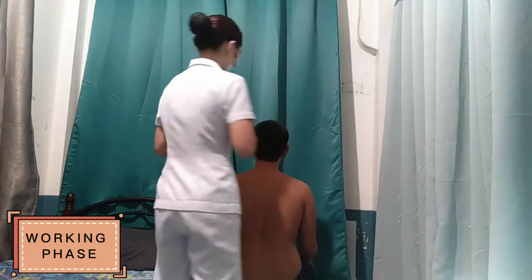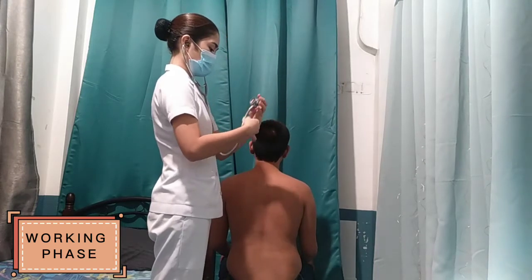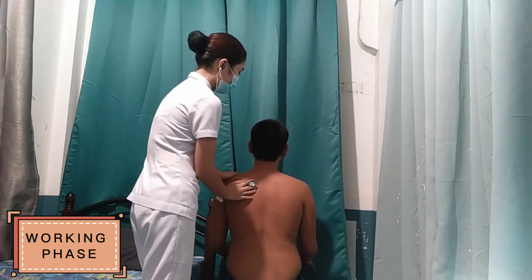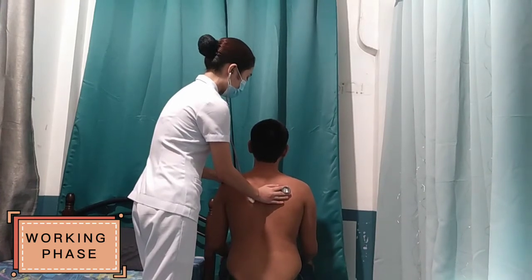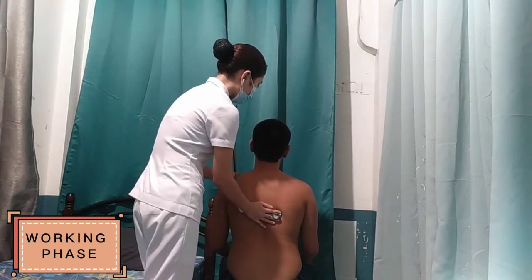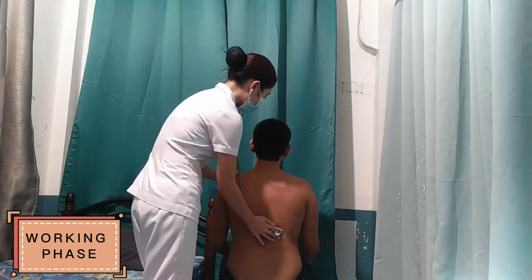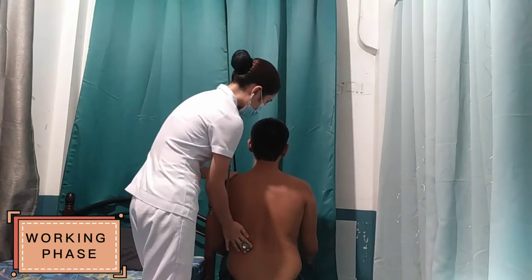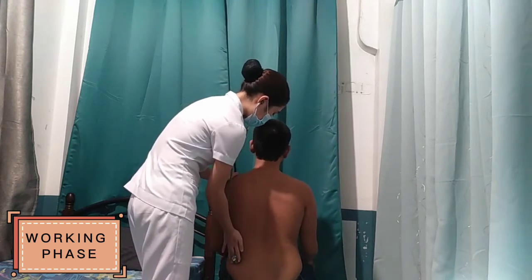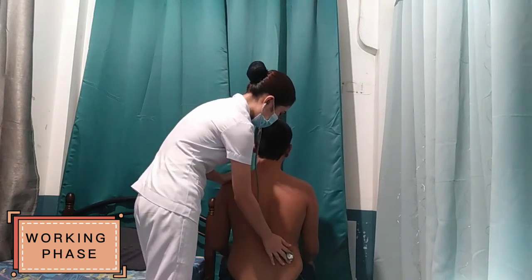Right, sir, so I'm going to auscultate you, sir. Okay, can you inhale, sir? Exhale. Inhale. Exhale. Inhale. Exhale. Inhale. Exhale. Inhale. Exhale. Inhale. Exhale. Inhale, sir. Exhale. Inhale. Exhale. Alright, sir.